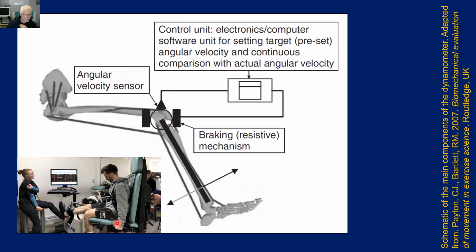So the limb would move, in 1 second it would move through 60 degrees of range of motion. But what you have to remember is that in any movement, as the limb moves, it has to start from a zero angular velocity, and it will in essence go up to the angular velocity we're after, which in this case is 60 degrees per second.